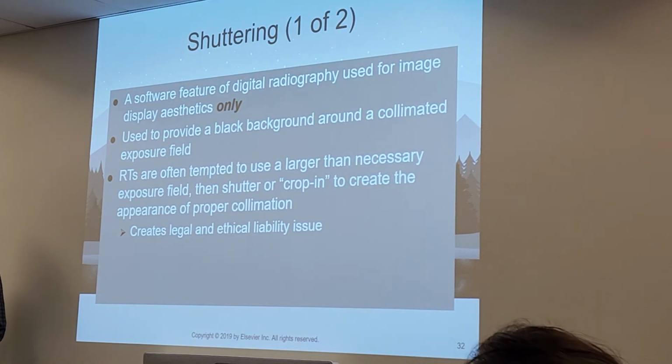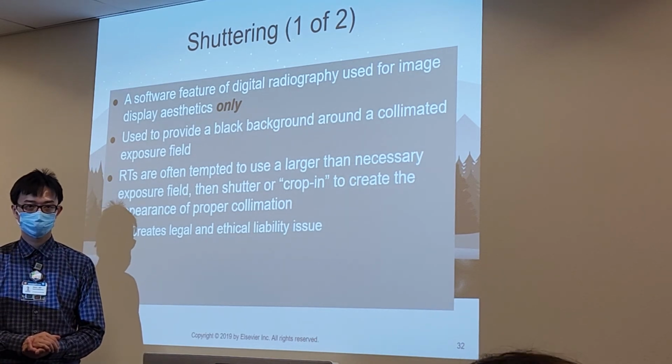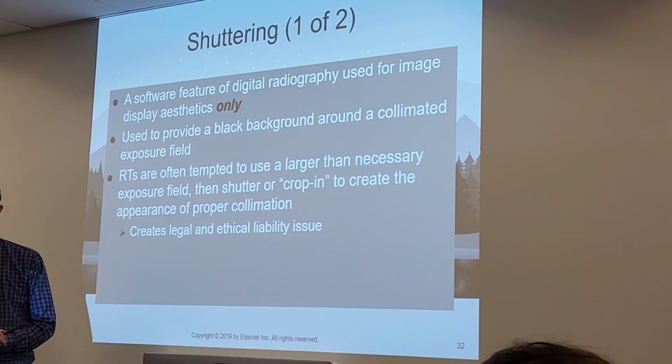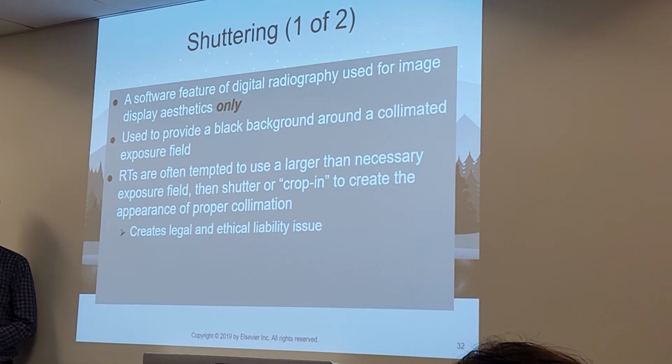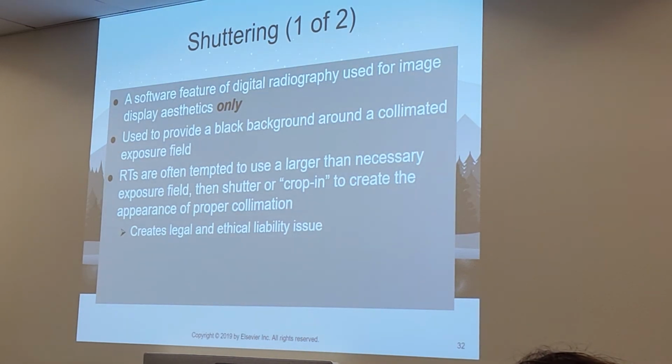I have a question. Now I've made that mistake by not collimating correctly. But to get a better image for the radiologist, is it okay to collimate, even if you're photoshopping it? Yes, you would still end up collimating to send the radiologist a proper looking image. But do not use this as an alternative to collimation. If you make a mistake, then sure, just bring it back down. If the computer makes a mistake and gives you extra stuff outside, you can bring it back down.